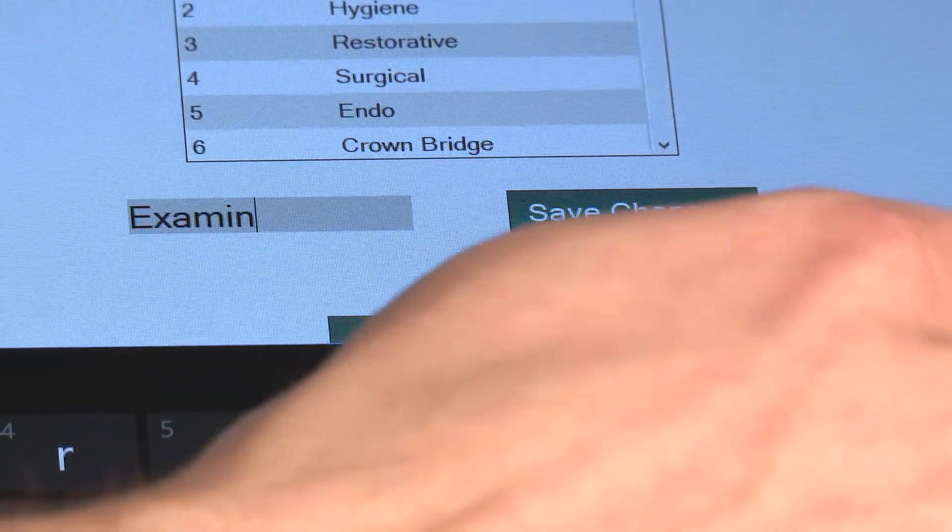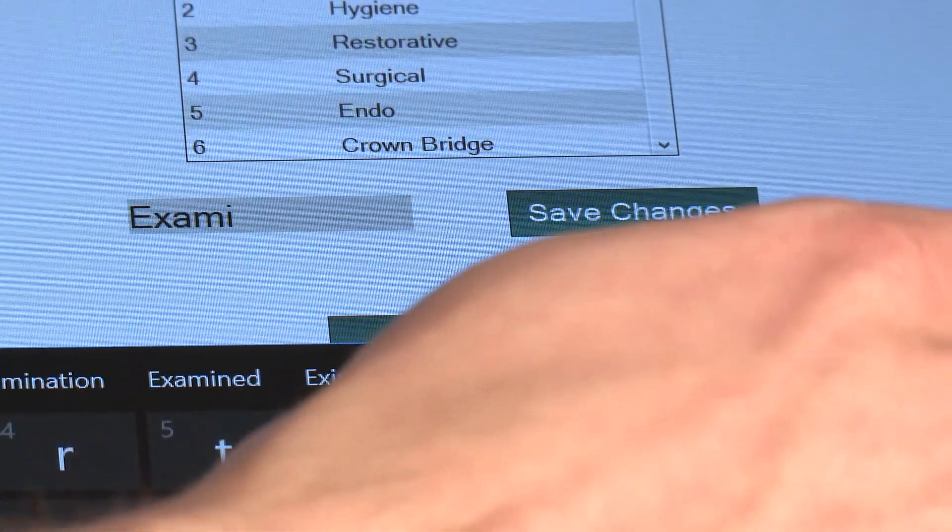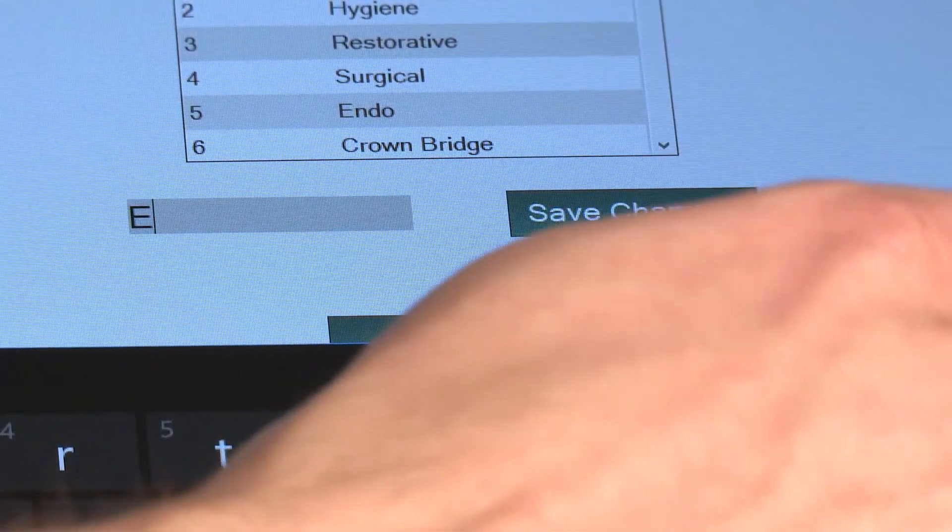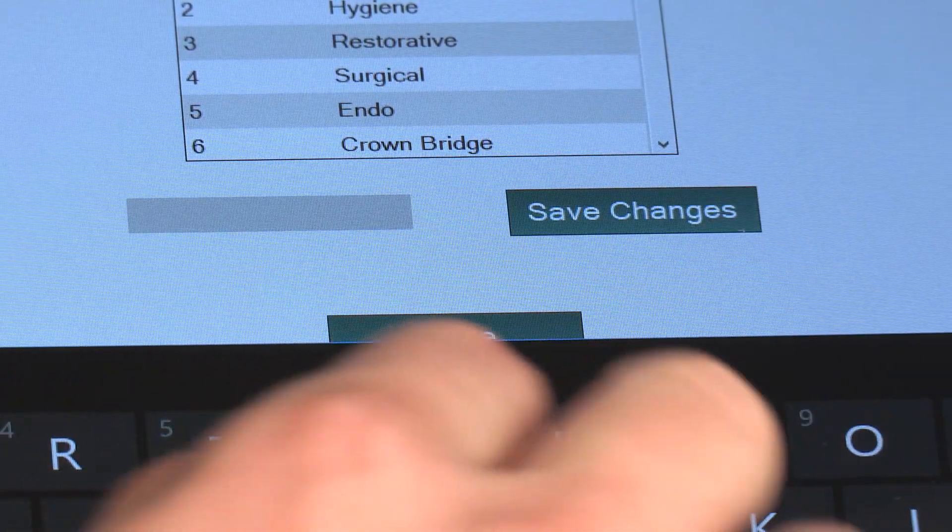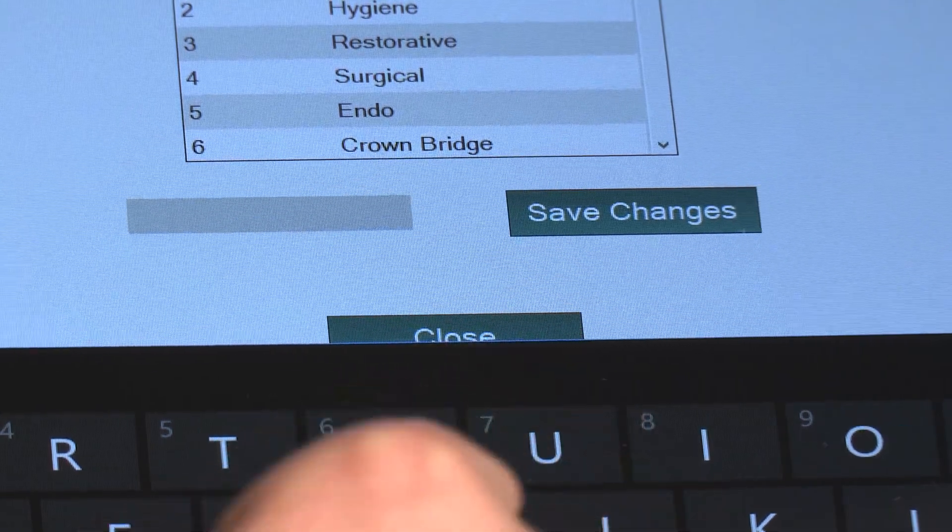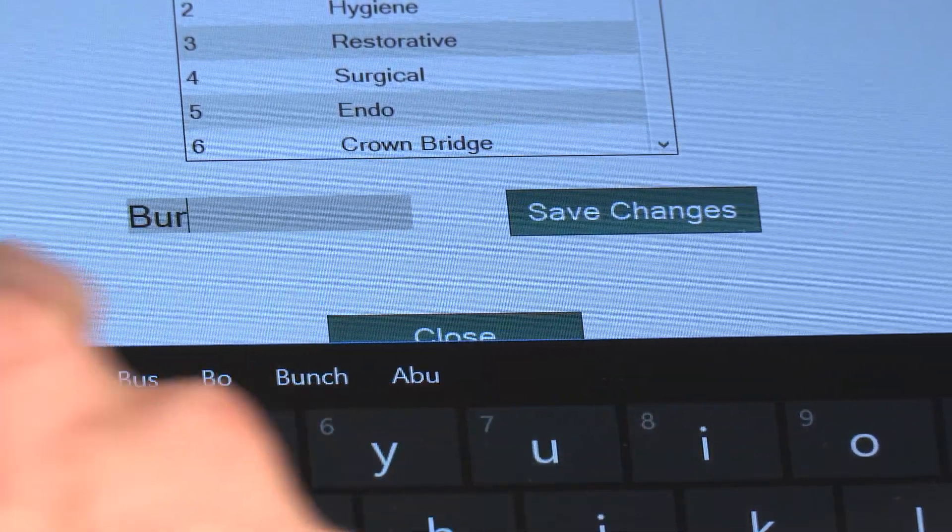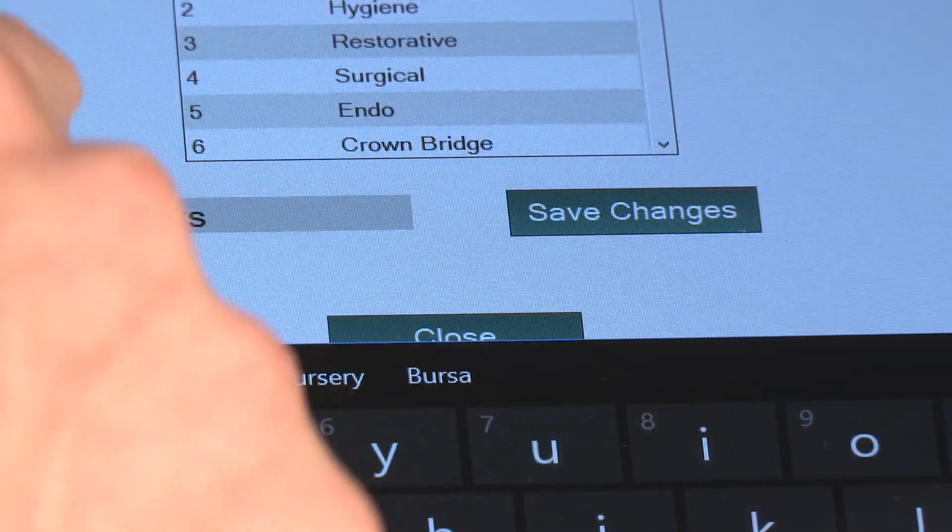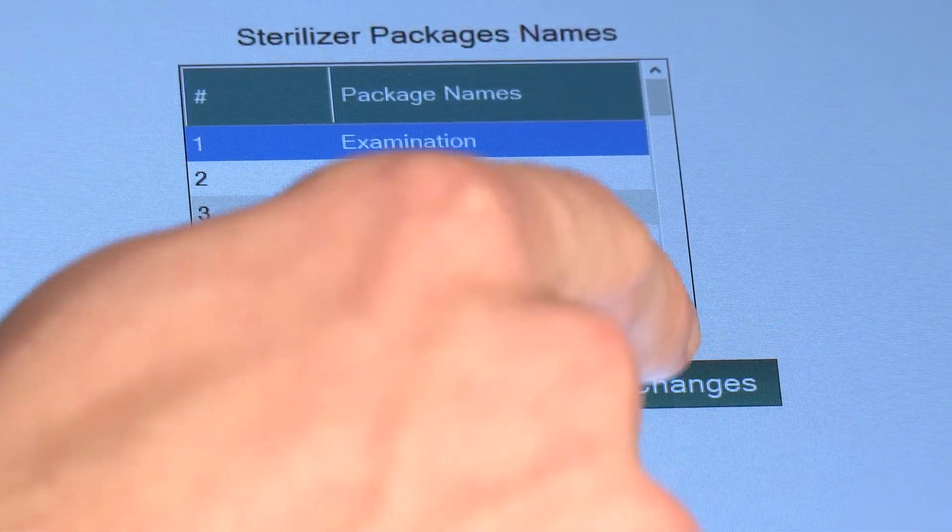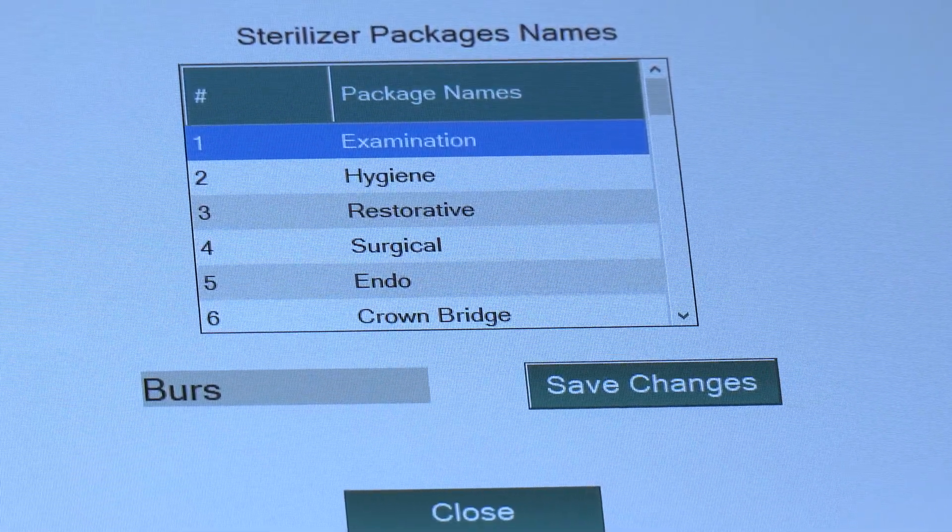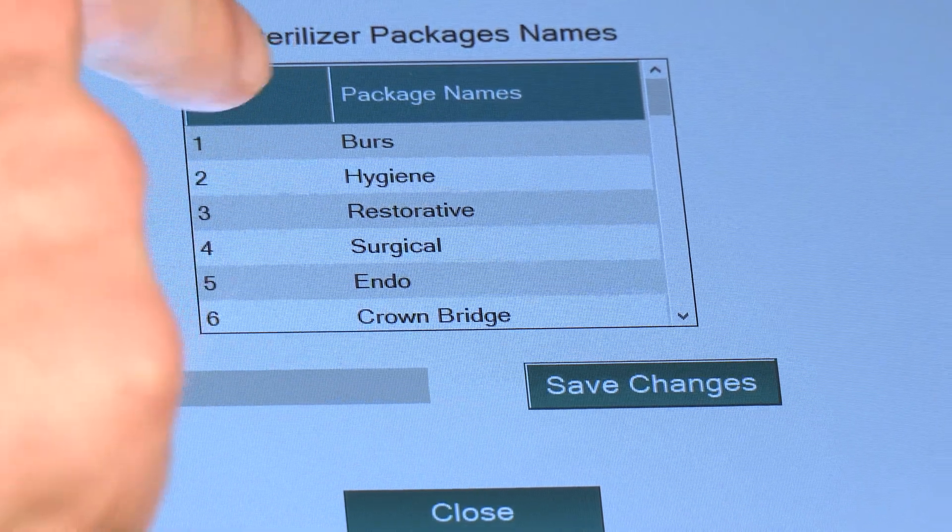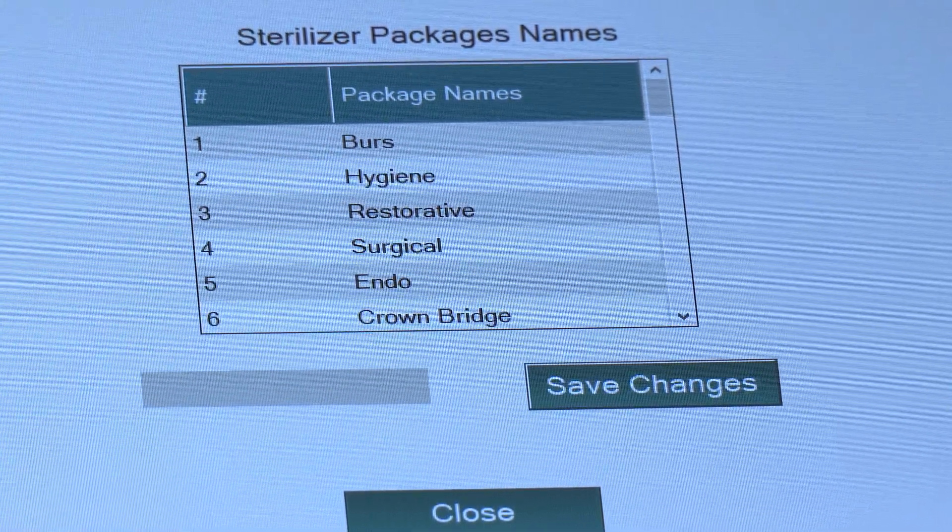So instead of Examination, if for example we wanted to use Burrs, we would just key it in and hit Save Changes, and now notice that Burrs is on the top.